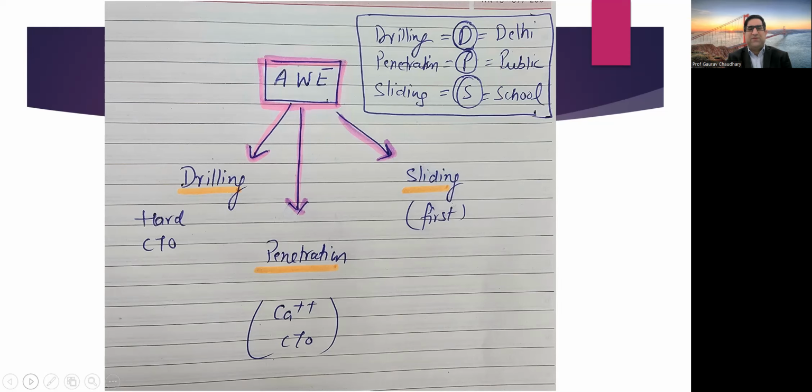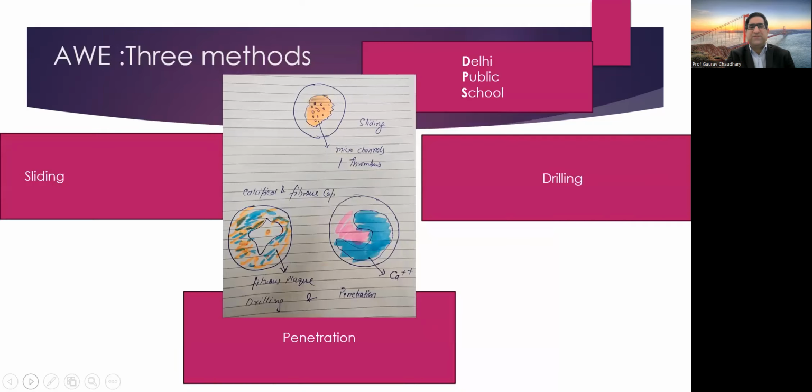And if it is not possible, and we can see the CTO's body is hard, then many times we need to drill the CTO. And if it is a short segment containing calcium, then of course penetration by needle-tip wires like Conquest Pro is the best strategy. So again, coming to what these three methods mean.